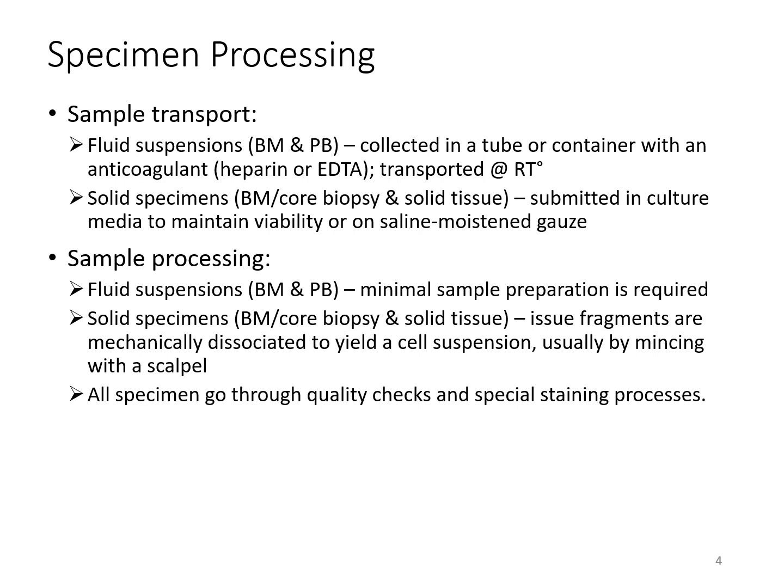Your solid specimens are going to include things like your bone marrow core biopsies, your tissue samples, things like that. They're going to be submitted in some sort of culture media that's going to maintain viability. It's going to be a sterile container, of course, or it could be something that has a little bit of saline in it just to maintain moisture so those cells don't dry out.